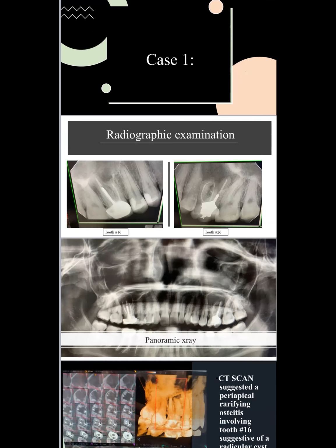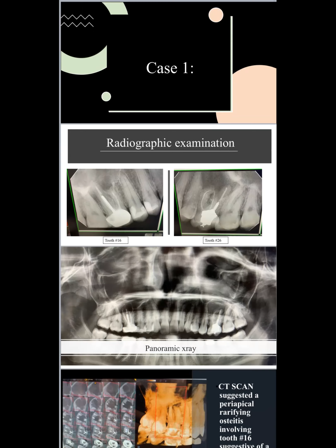Can you guys see my screen? Yes. The voting is 16 out of 24.